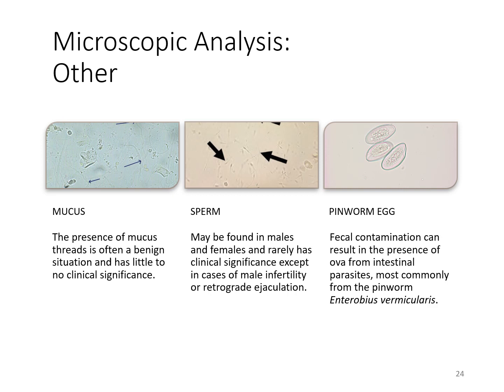Reporting sperm in a male could be significant depending on the health status of the man. Pinworm eggs could be seen as a cross-contamination from feces, so noting that in urine would be significant.